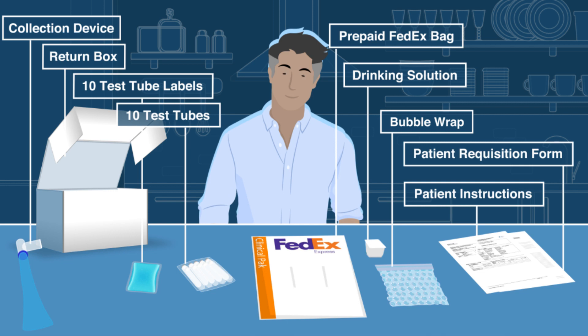Please note that 10 test tubes and labels are provided, but you will only use 9 test tubes and labels. Additionally, please verify the order form and box are labeled with the correct name and date of birth.